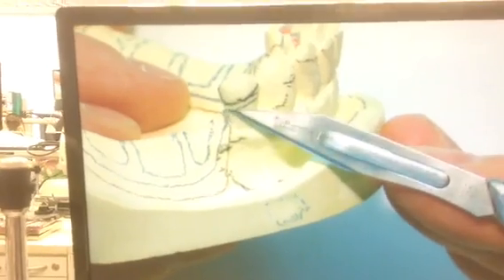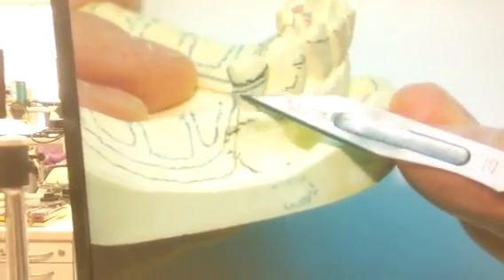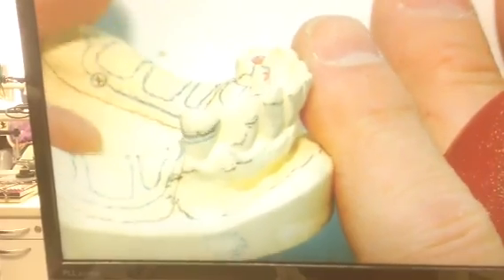The reason I don't particularly like an RPA clasp is because since this whole entire clasp is in the undercut, the lab has to block this out with wax. So if you turned your partial upside down and looked, you would see a space right in here, underneath that clasp arm. To me, that's just a food trap, a way to catch every piece of spinach you're going to eat. So I don't particularly like an RPA.